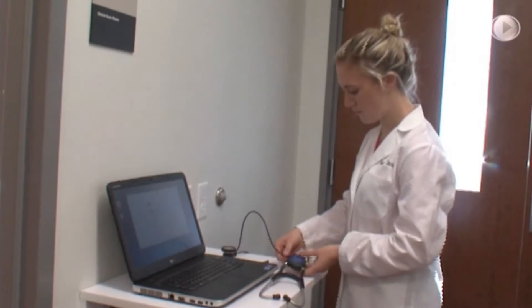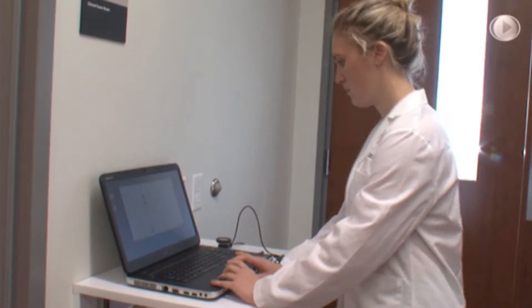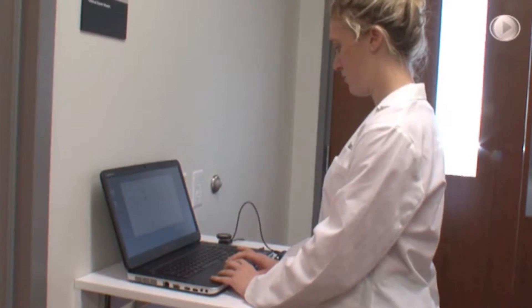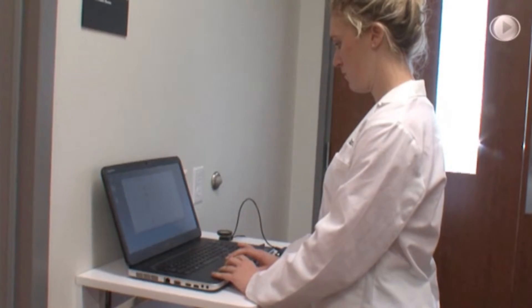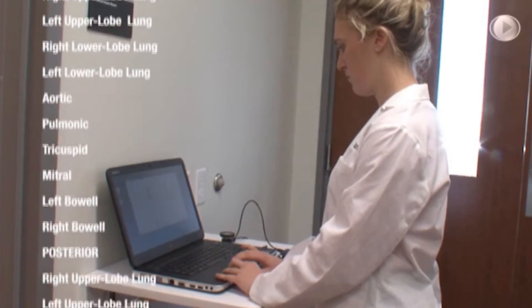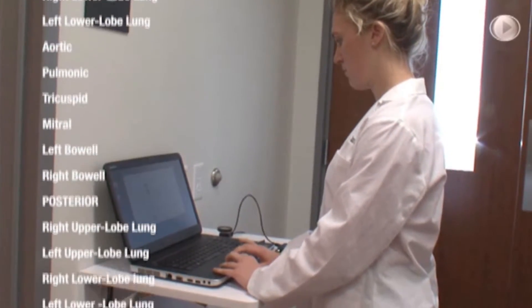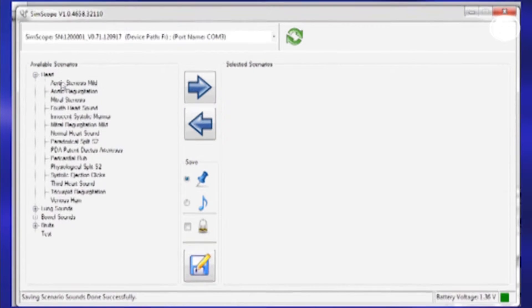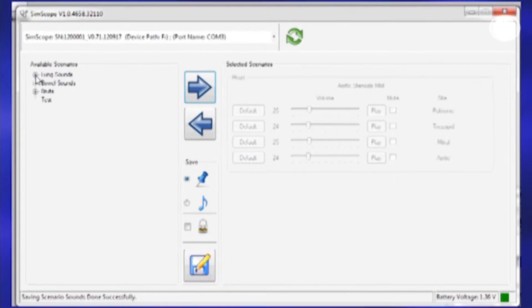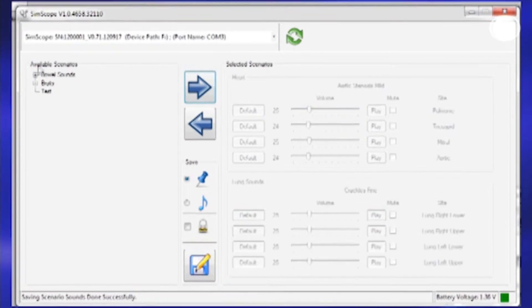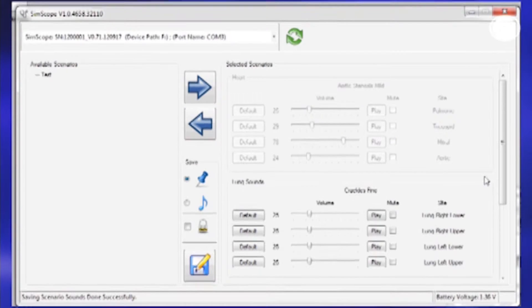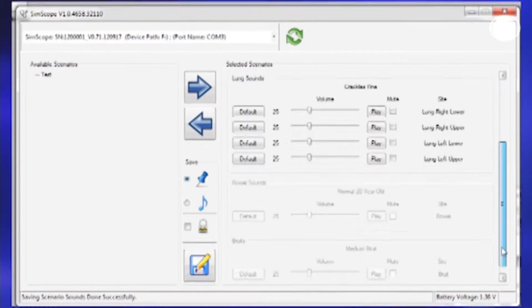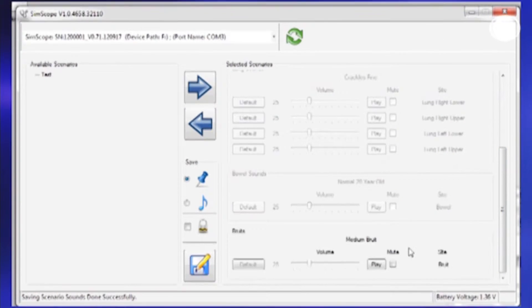The SimScope stethoscope can be programmed to fit specific diagnostic cases and can interact with over 15 locations. The SimScope software utilizes the extensive Cardionics proprietary sounds library and adapts to specific user requirements, allowing virtually unlimited scenarios.